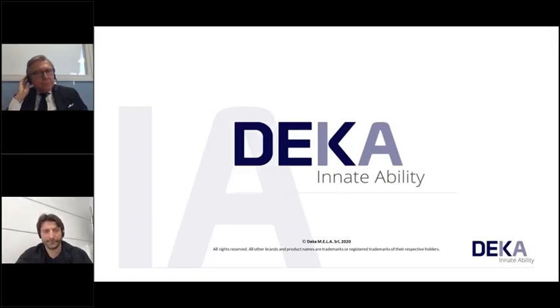In the same track of the tricks, when we're using the CO2, how can we avoid the stamping post-fractional CO2 laser? The pixel image, you mean? Exactly, the square demarcation lines after the fractional CO2. Well, when we had the previous SmartXide dot, we got a lot of these pixel images that remain for a long time. But I noticed that actually we have at the end the improvement of the pixel images.